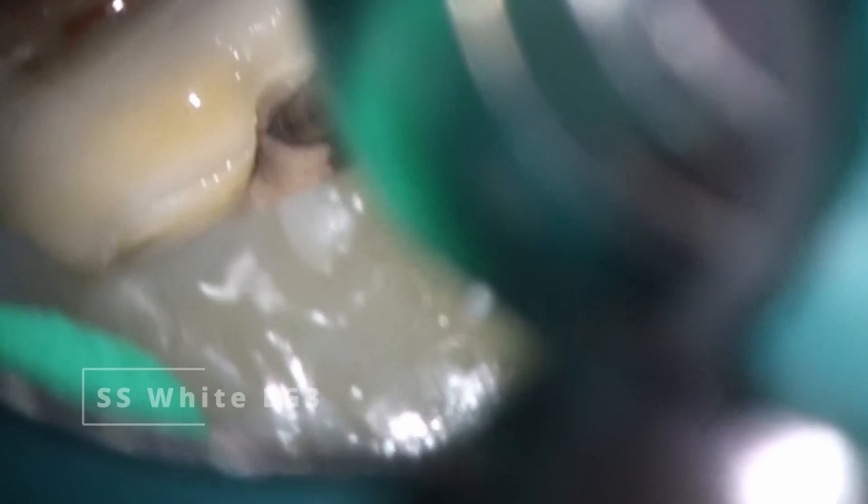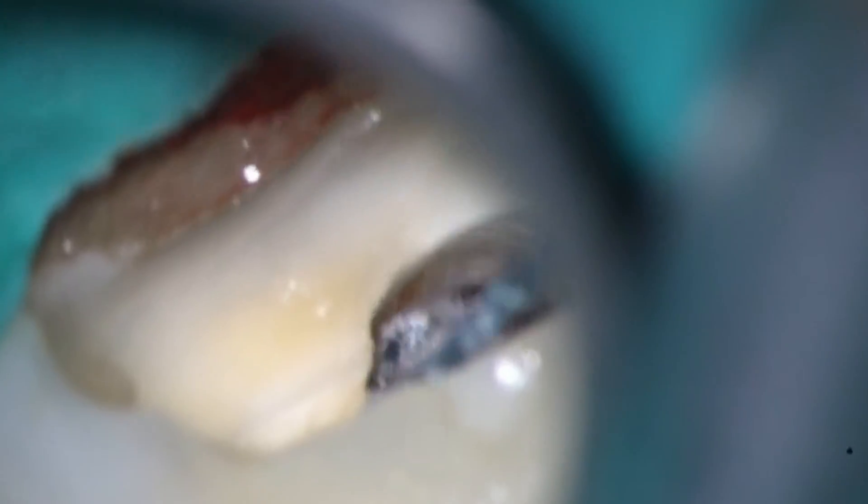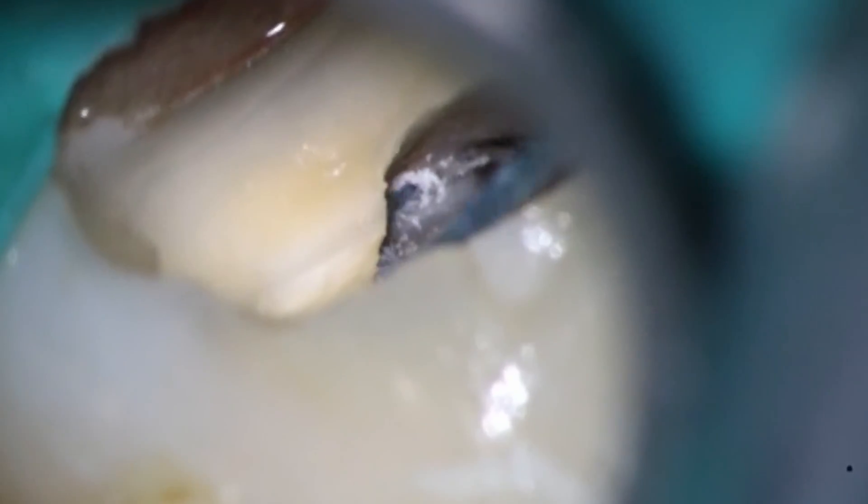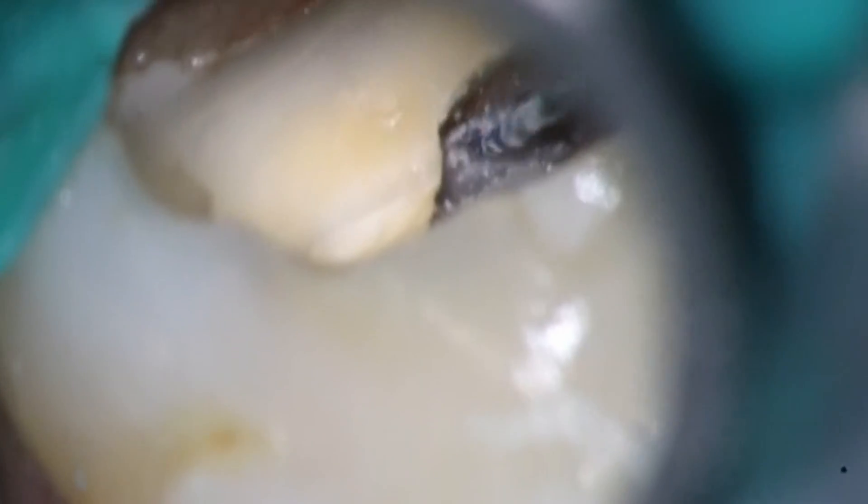Going back in with a 6C file — going a little bit smaller to see what we can grab. You'll notice as I'm working it's moving in that direction mesially. So as that file goes, you can see it wants to go mesially. What I'm going to do now is take the EG3 and move that mesially. You want to use really skinny hand files, see which direction they go, and then use either a very skinny ultrasonic, a Munce bur, or EG3 — whatever your preference is. Shout out to Ravi Koka in San Francisco, one of my great teachers from UOP who taught me this technique many years ago, and I still use it with quite a lot of effectiveness. Also poke along in the middle — sometimes there's going to be almost like a little isthmus forming in there, and where the MB2 starts is not where it ends up. You can use that 6C as a scouting instrument along the entirety of that calcification. Taking the 17 down — still not getting too much, but I am starting to get almost a sticky feeling, like sticking a rotary file into a piece of rubber — that's kind of the sensation you want to feel.